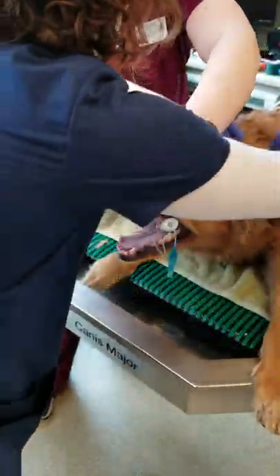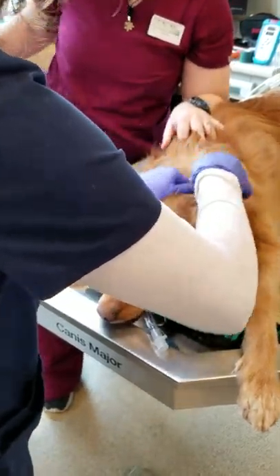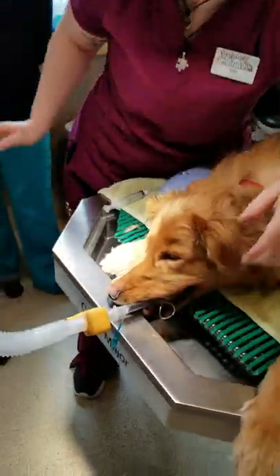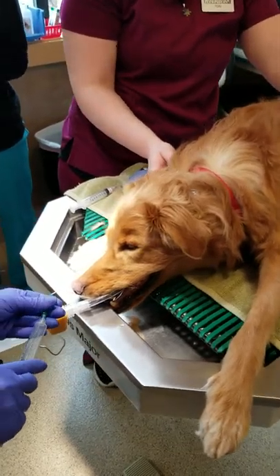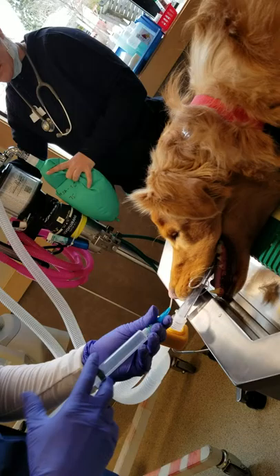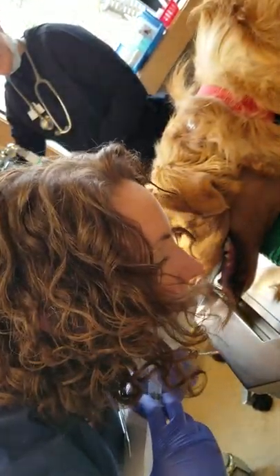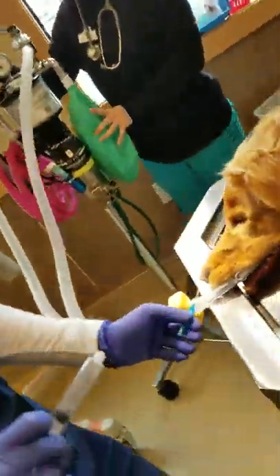Tie this. As I'm filling my cuff, if you can go ahead and give a breath. Breathing. Release. Breathing. Release. Breathing. Release. Perfect. I'll get a new breath on.